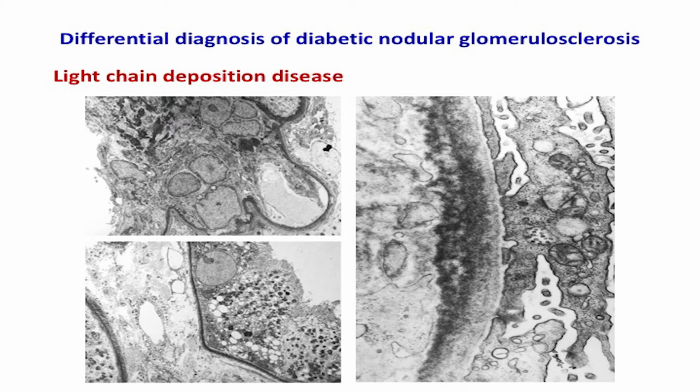So when you send the biopsy to your pathologist with the question, is it diabetes or light chain deposition disease, have a thought for them. Send them material sufficient for them to do immunofluorescence, because they can't demonstrate light chain restriction on peroxidase, on paraffin sections very easily. And if they say, sorry, I can't tell the difference because I can't do electron microscopy, that's the truth.